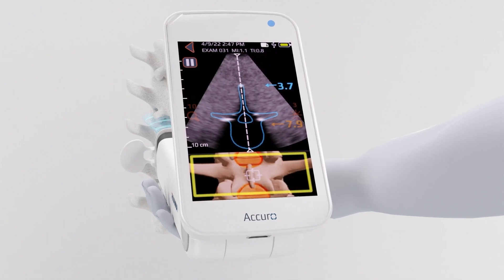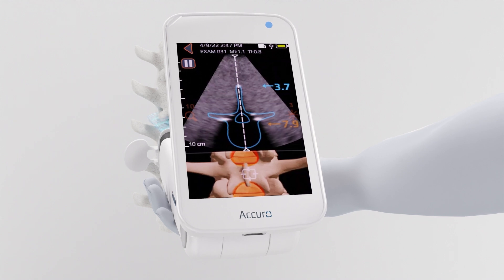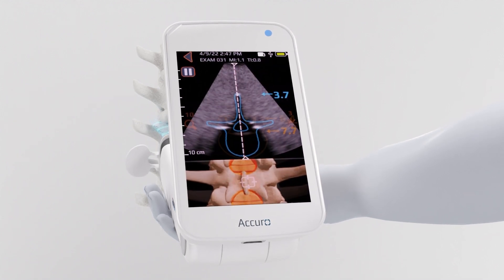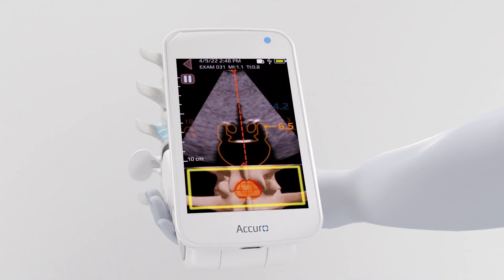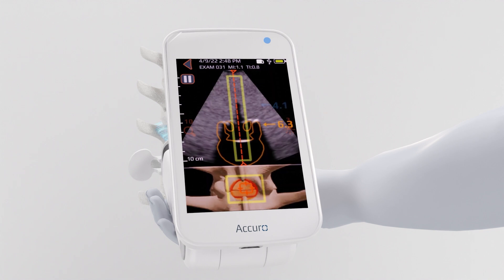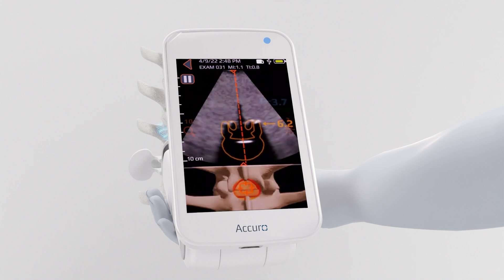The target in the 3D image will be over the interlaminar space. Notice that the dotted line in the ultrasound image and the crosshairs in the 3D image turn red when you have reached an interlaminar space at midline.